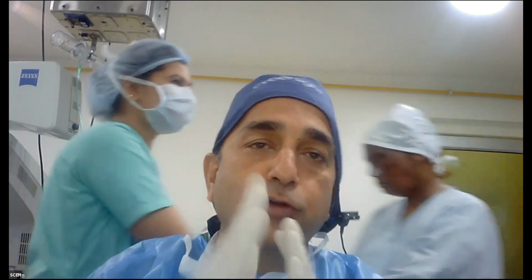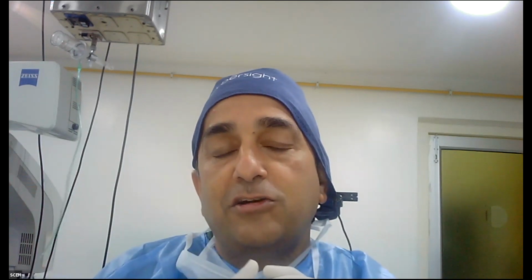The torsional power is very interesting because, as we discussed, longitudinal power basically goes back and forth. The tip goes back and forth in a longitudinal fashion, but it's a repelling force. So there is chatter because of that. You want the piece to be cut and then sucked in, but the longitudinal power has a tendency to throw it away.